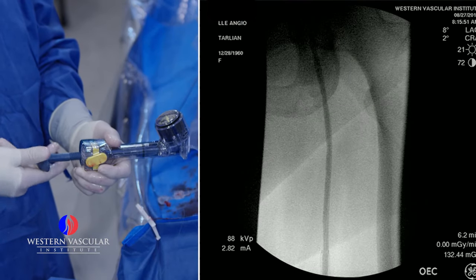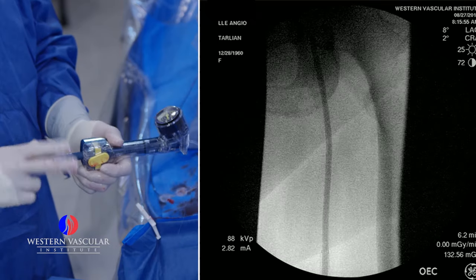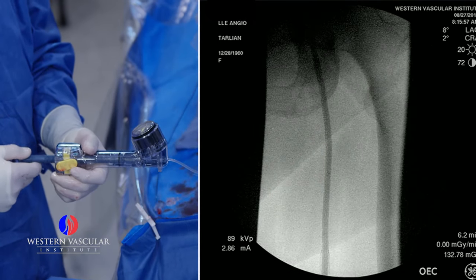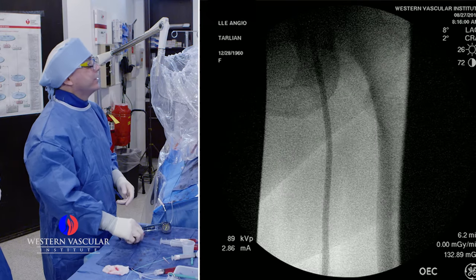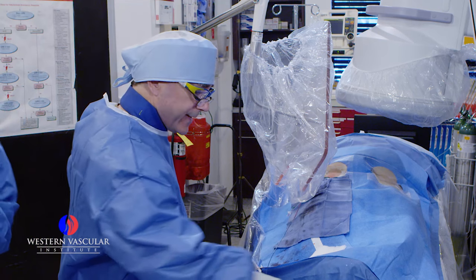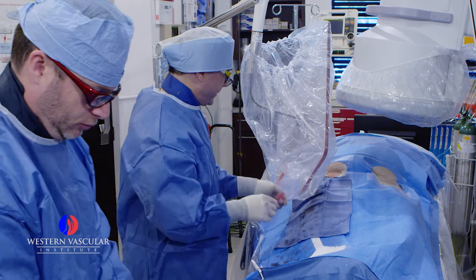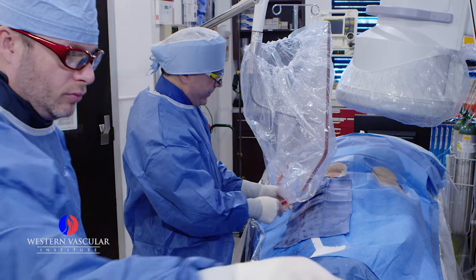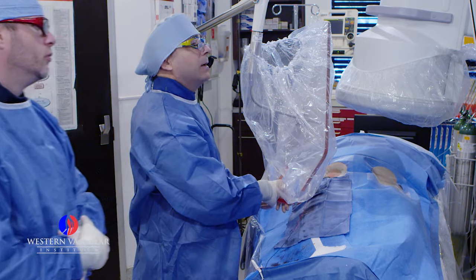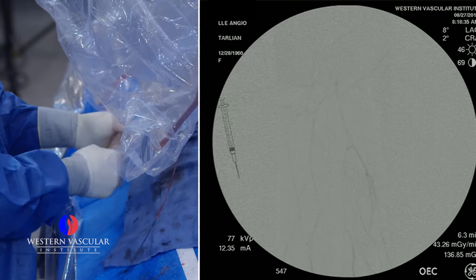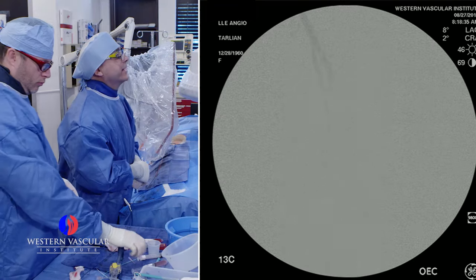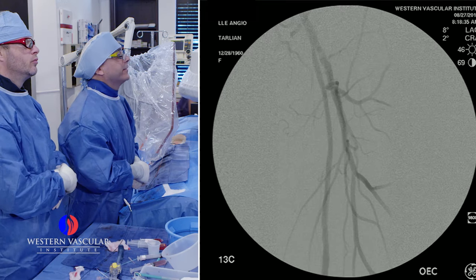We inflate nice and slow, bringing it up to eight to ten atmospheres, which is when the balloon assumes its normal diameter, and we'll leave it there for about a minute. Now we're going to take a final image and see what we have — we're looking at the top part of this artery. That looks pretty good. I don't see much in the way of dissection. I think we can leave that alone and not stent it.